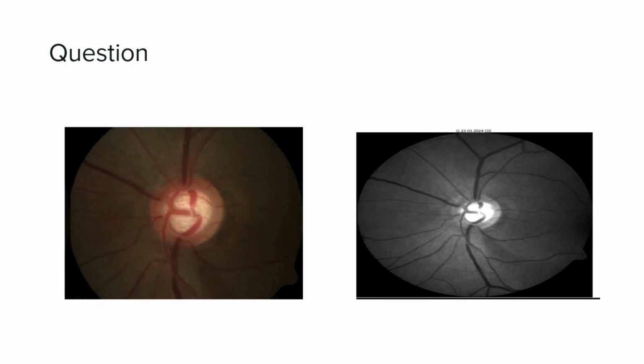Okay. So here, in spite of the rim not looking too bad, you can see the RNFL defect. So you have to point out the inferior rim. Point out the inferior rim. Or go there and point it out. Show the inferior rim. The width.